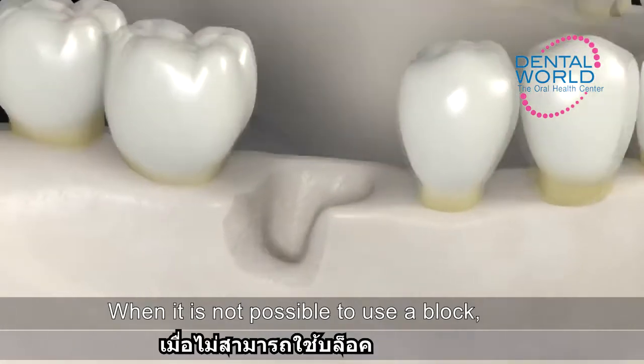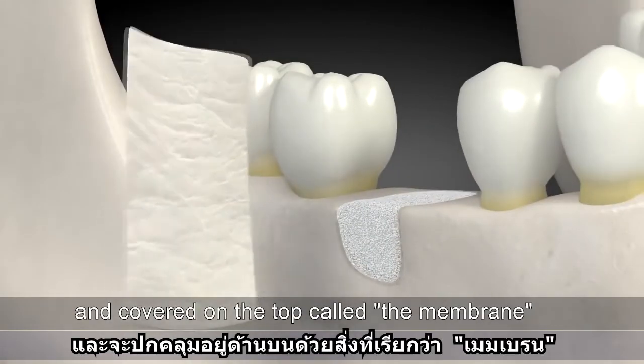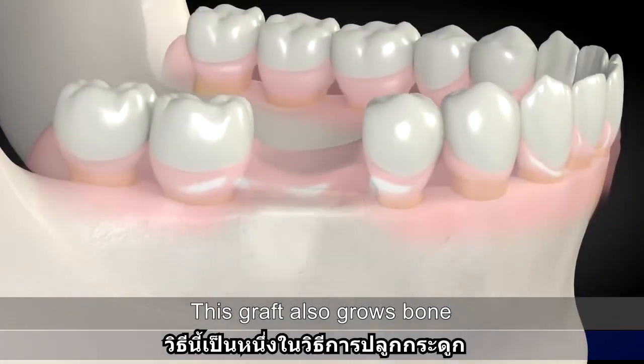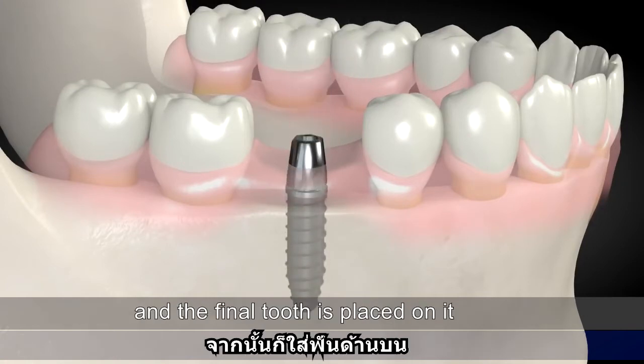When it is not possible to use a block, a softer mix of bone substitute is placed where bone is missing and covered with a membrane. This graft also grows bone. When the bone heals, a dental implant is placed and allowed to heal, and the final tooth is placed on it.